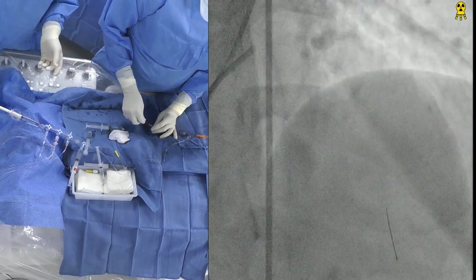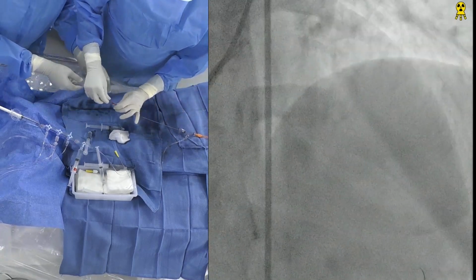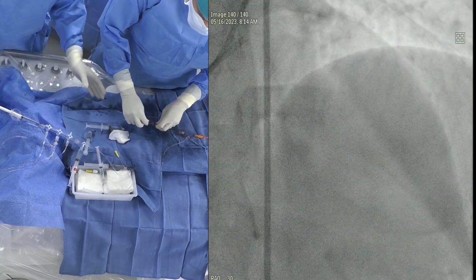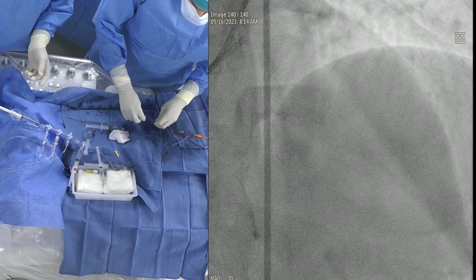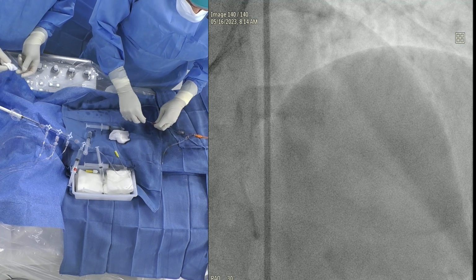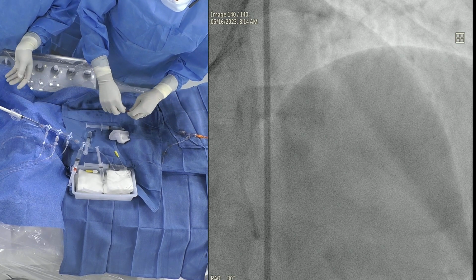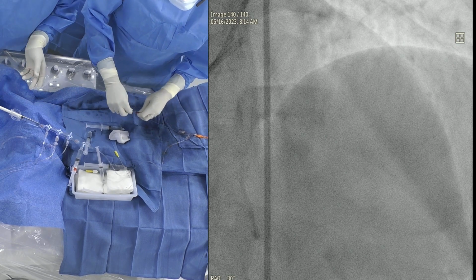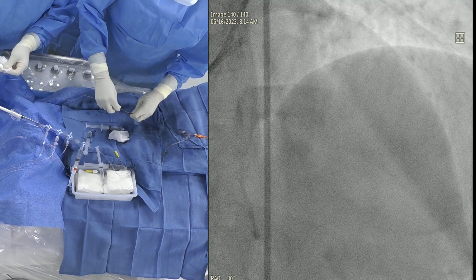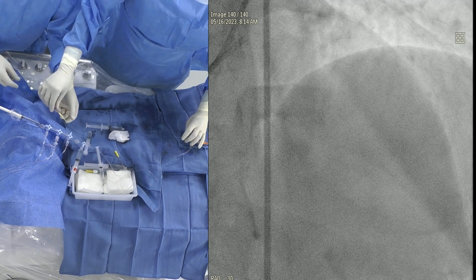Back to your conversation regarding IVUS, in addition to post-procedure use, in some cases it guides during the procedure also, including in CTOs and a few other instances. I would say the second use during the procedure could be the group of CTO, but you need to be expert on that. And secondly, you need an 8 French guide to have an IVUS catheter, and then you put a parallel wire with your over-the-wire system to puncture where the ostium is, which is an ambiguous cap, and so you'll require an 8 French guide.